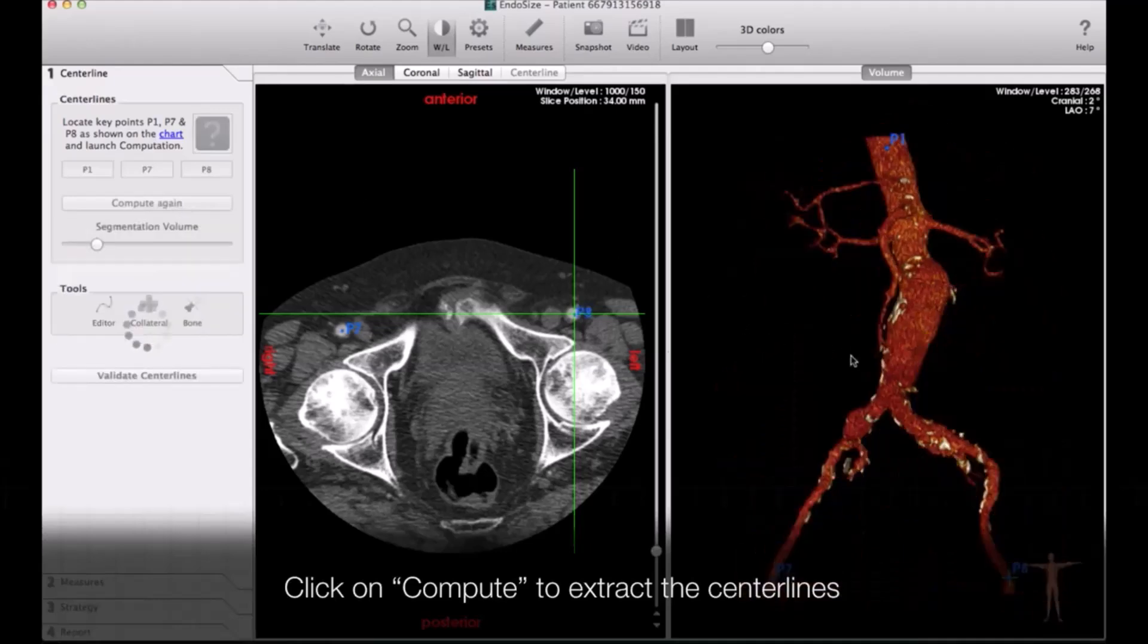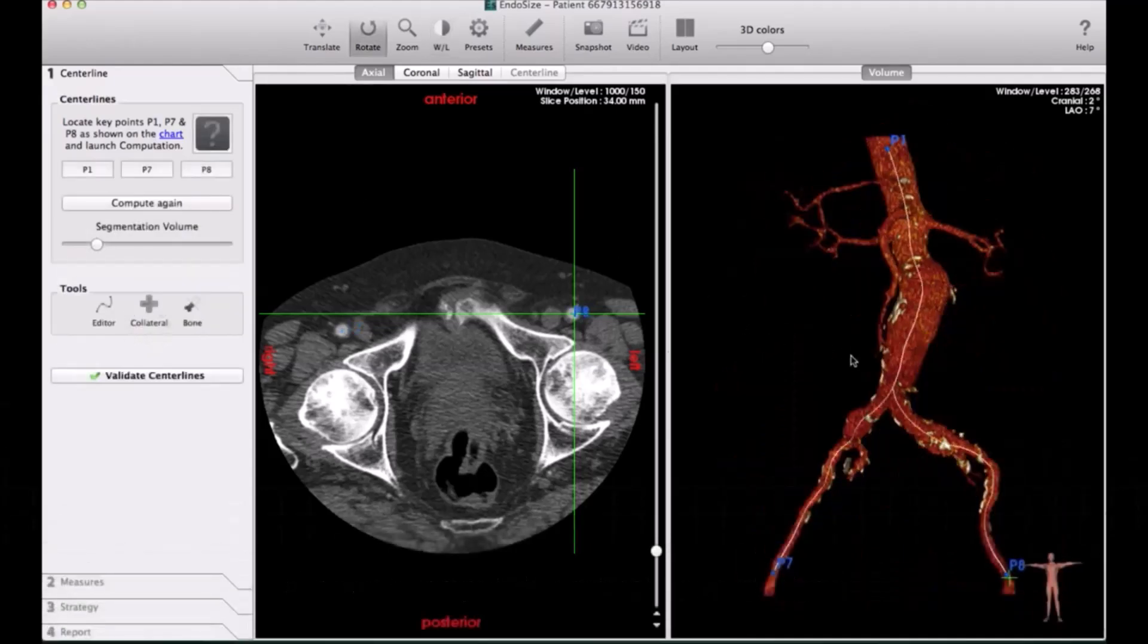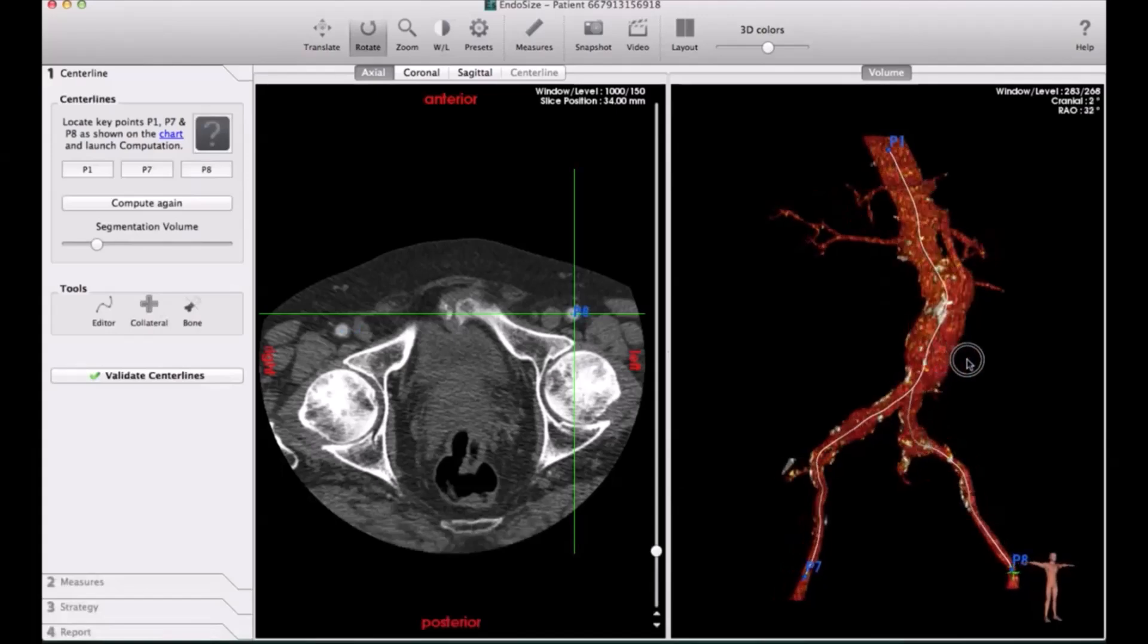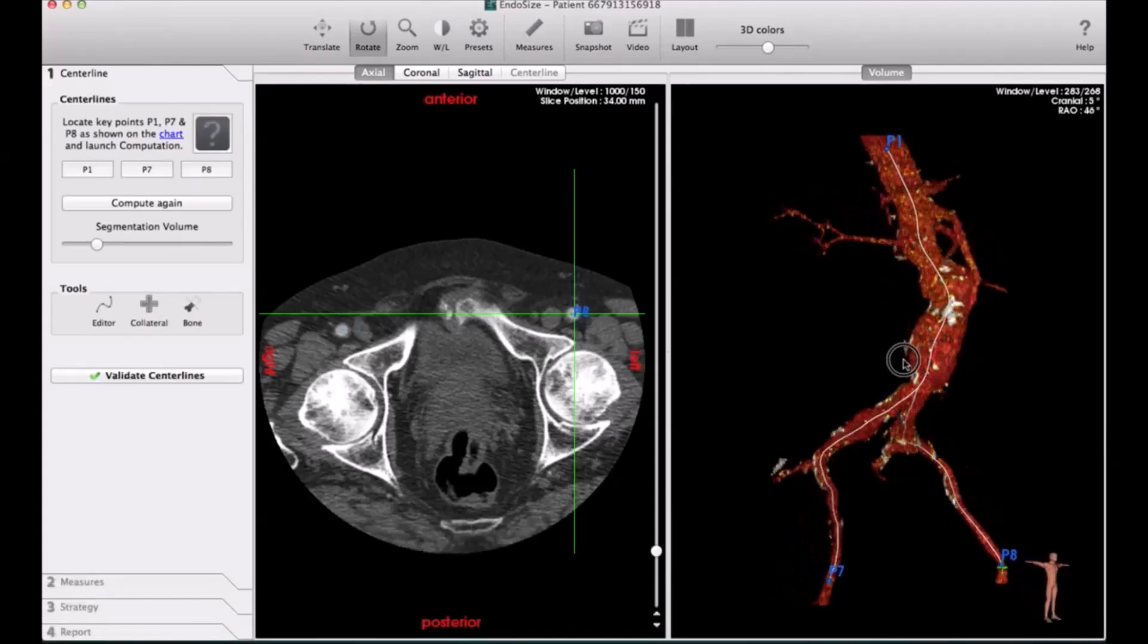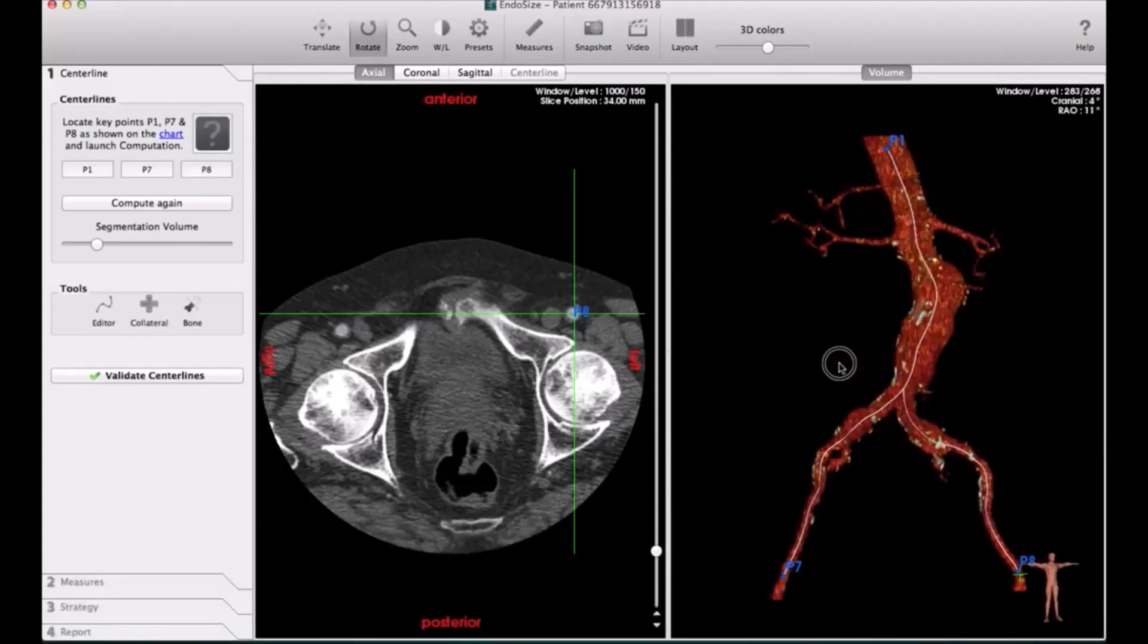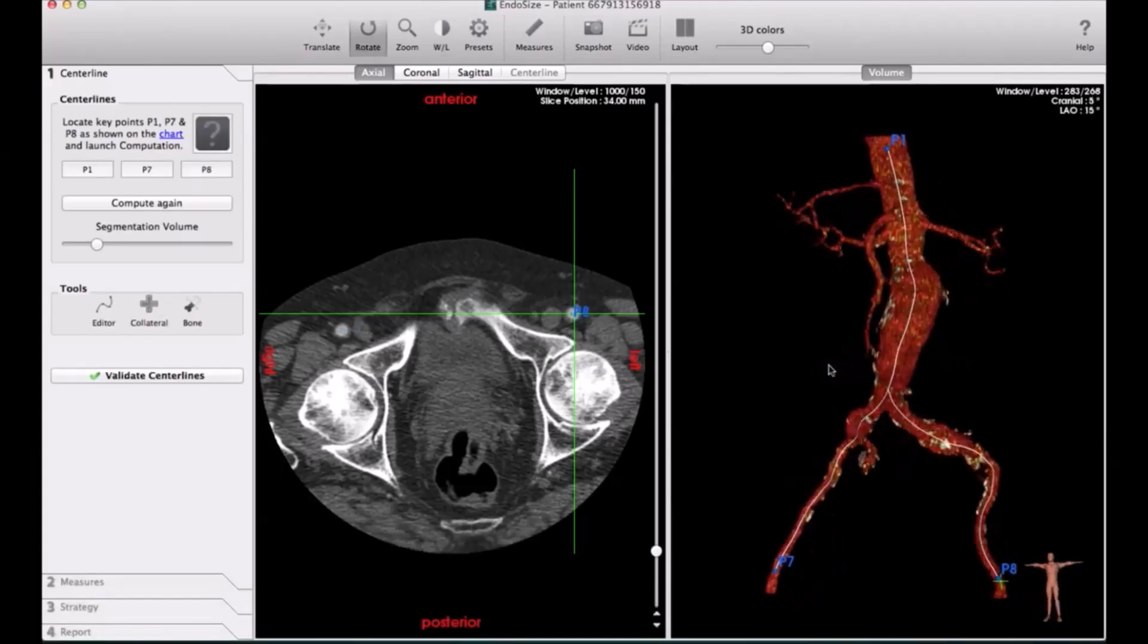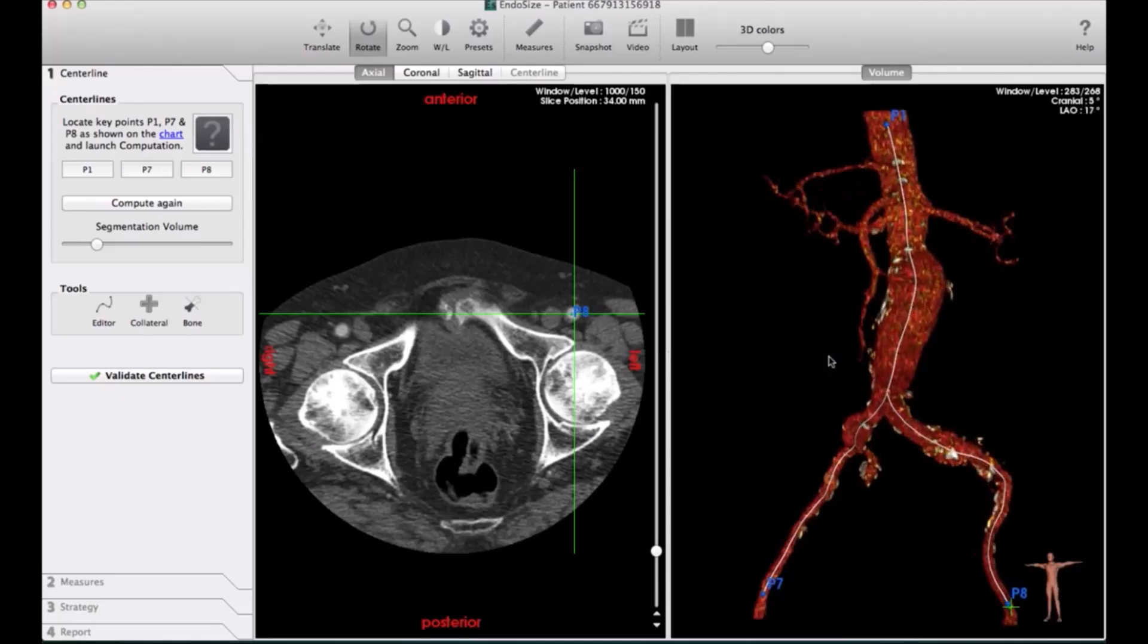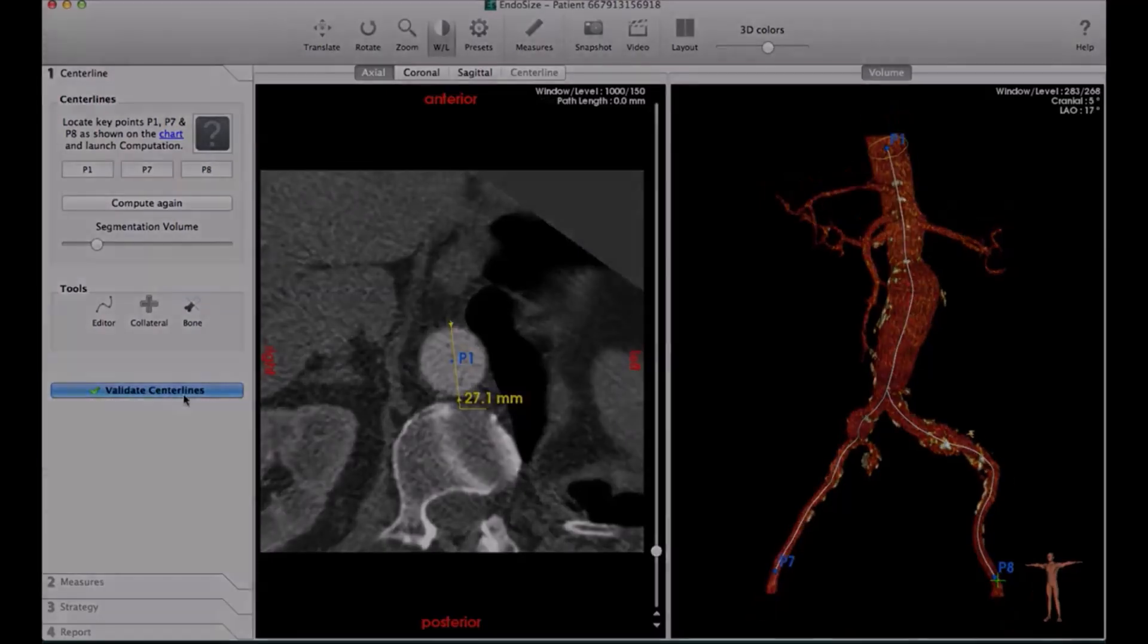All this is done automatically, and you can look at the aneurysm on the right-hand side, the 3D reconstruction, and you can do the MPR shape.